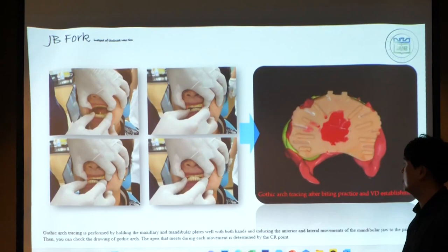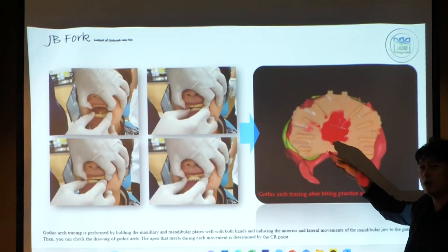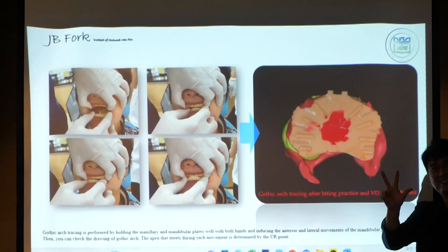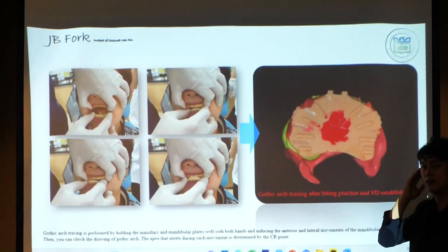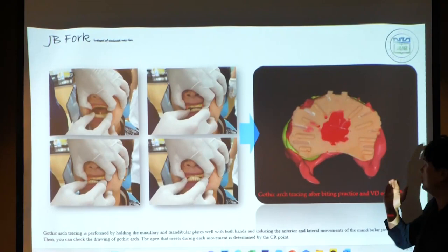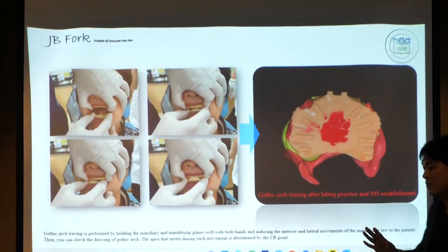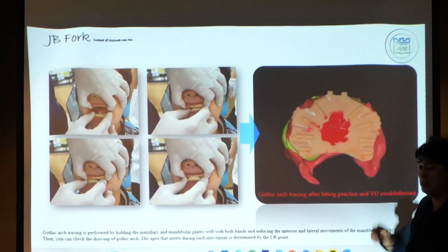So when I see this Gothic arch tracing, this patient definitely has a problem in the TM joint. If the patient doesn't have any problem in the TM joint, the tracing shows like this. Yes, like a bird's foot, right? But this patient showed a wide range of tracing. That means maybe she has some problems in the condyle or TM joint. Anyway, we can check the point gathering each movement. This point is the CR point. Some references recommend 0.2 millimeter anterior to this point, but it's not necessary, I think. So anyway, punch this point with the round bar.